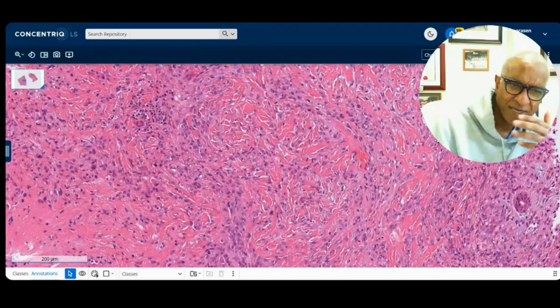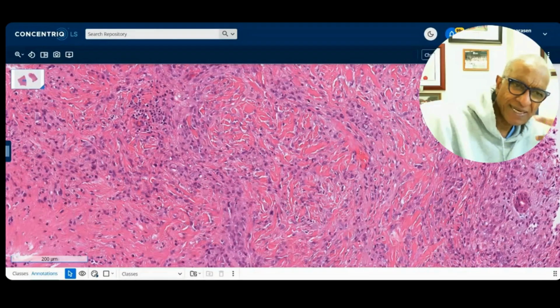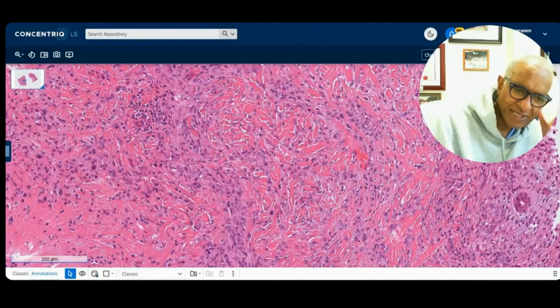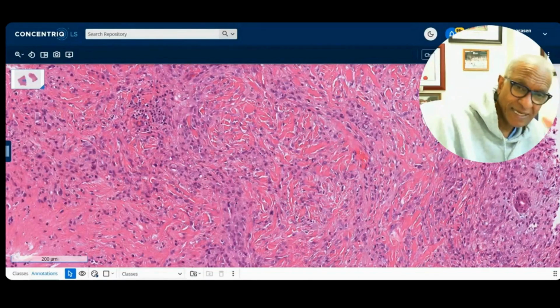Keratin, EMA, CD34 helps you rule out carcinoma, and then thinking about the rhabdoid cells fitting in nicely with epithelioid sarcoma. The location of this is more proximal. But when you read the original paper by Dr. Fletcher, I think it goes back to '98, '99, AJSP, the first author is that nice man from Switzerland, on the border of Switzerland and France. I forget his name now. When you read that paper, or even look at the pictures, you'll see lots and lots of large pink cells around large areas of necrosis. So the morphology is really atypical for classic or conventional epithelioid sarcoma. This one seems to be more conventional in its morphology, 41-year-old, scrotum.